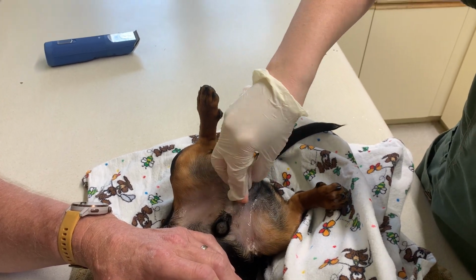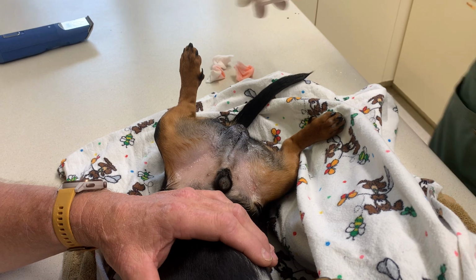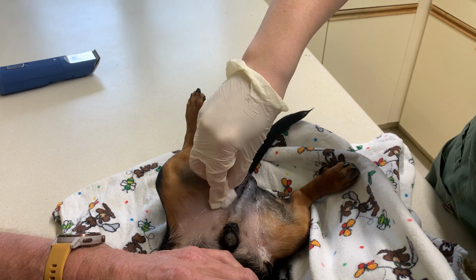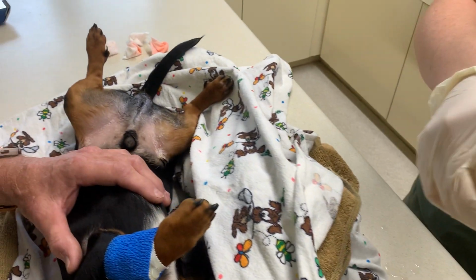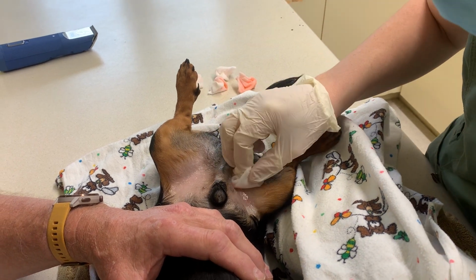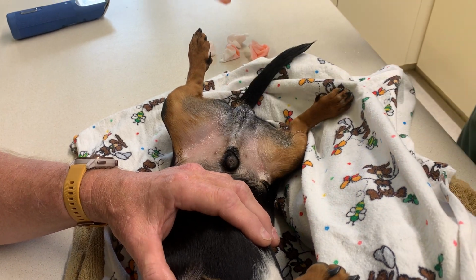That's okay, you're all right. And we're going to turn and just move in circular scrubs. Another water. Add a chlorhexidine. And this is the last chlorhexidine one that we're going to do here. So the center, working out, making sure that the part that is going towards the incision is always going in the direction of the incision, and the part that is going out towards the outside of the hair is always facing in that direction. So always going in the same direction.